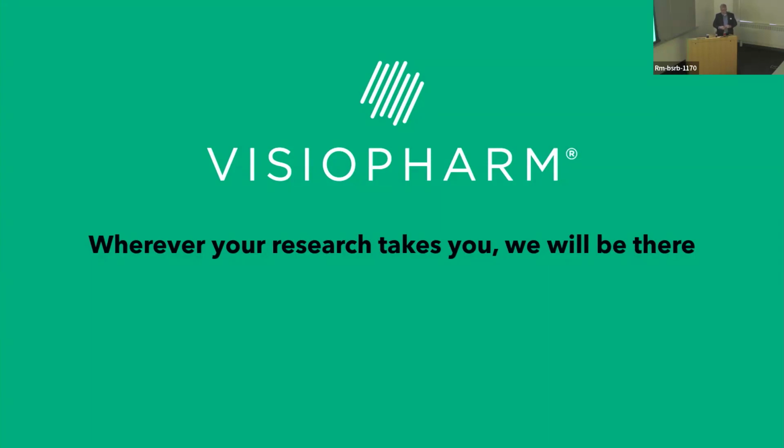What about the data sets that you upload to the Visiopharm? Take it right off of the Vectra Polaris or the PhenoCycler? Yeah, we work with the manufacturers to read their original data formats, their original metadata. It's all uncompressed, unchanged. We don't want to mess with the original data at all. We'll just read from their native file formats.